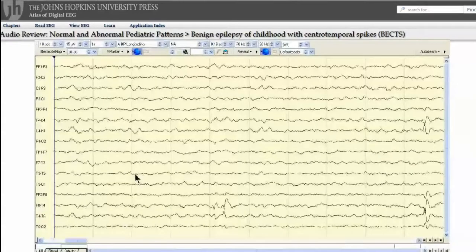As we progress the next 10 seconds, we can see that this is repeated as it continues along in this next segment. You can see over here at the far right the fact that it also displays very good field characteristics. By this we mean that the spike slow wave, although overlapping at this point, has distributed a field of slow wave activity that extends well beyond the actual phase reversal. These sorts of features are essential in determining the epileptiform nature of a discharge.